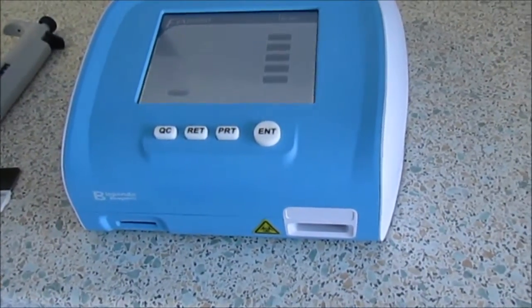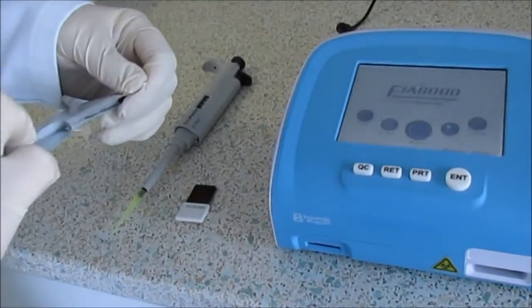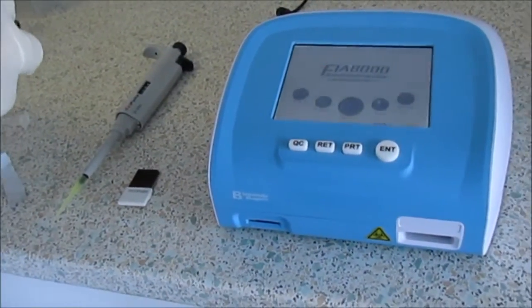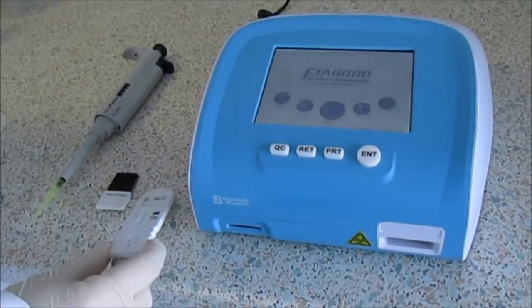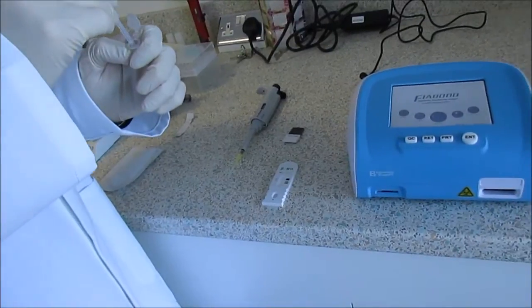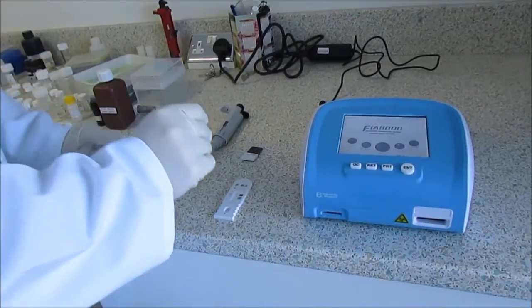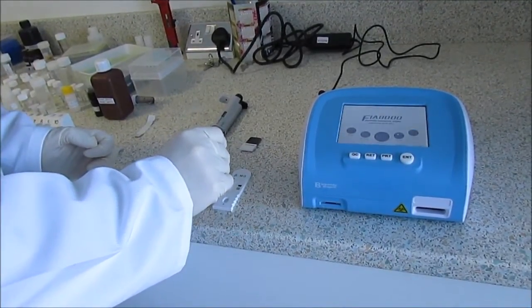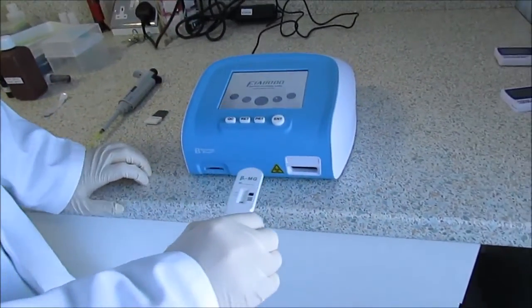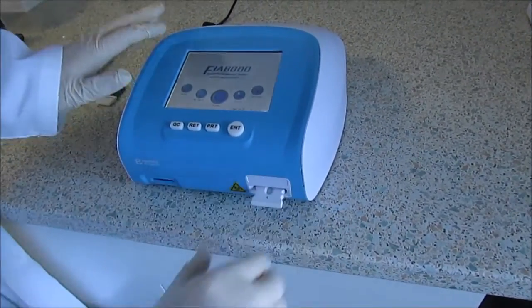You are now ready to perform a test. Open the foil wrapped cassette and place it on a flat surface. Pipet the desired quantity of the patient sample into the specimen well of the cassette. Then insert the cassette into the analyzer until you hear a click that ensures the cassette is firmly in place.